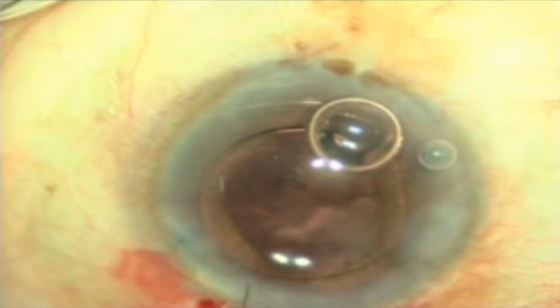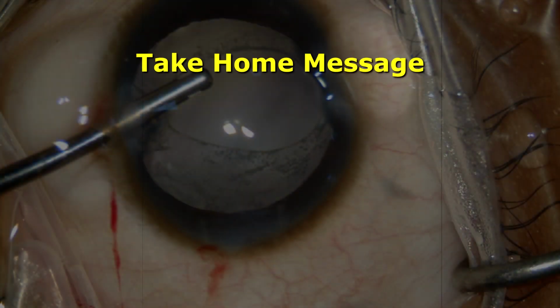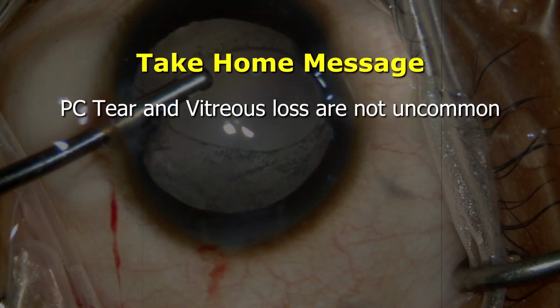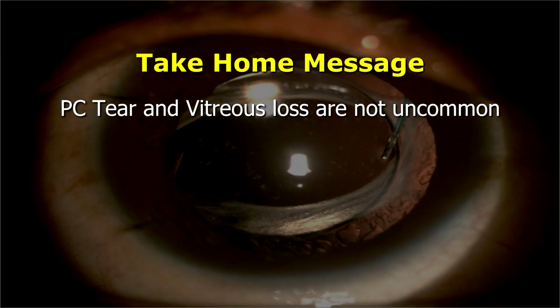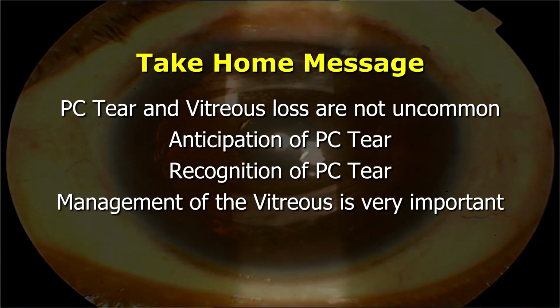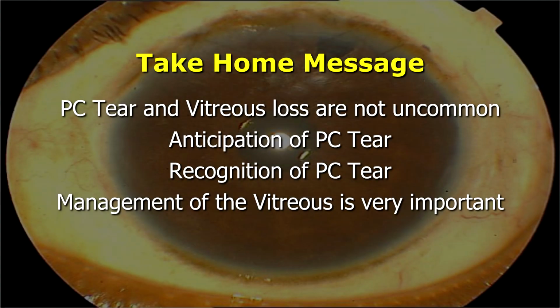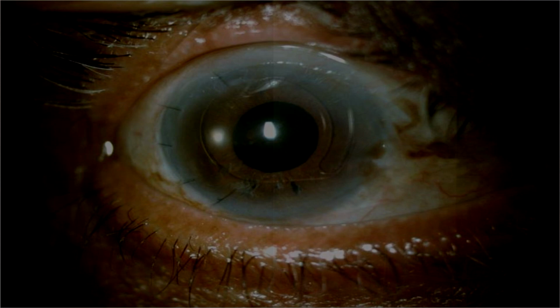The take-home message is PC tear and vitreous loss are not uncommon. They can occur even to experienced surgeons. Anticipation of the PC tear, recognition of the PC tear, and management of the vitreous is very important for a good outcome and long-term outcome for these patients.